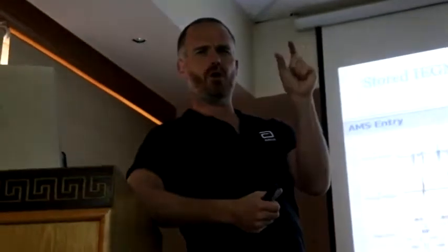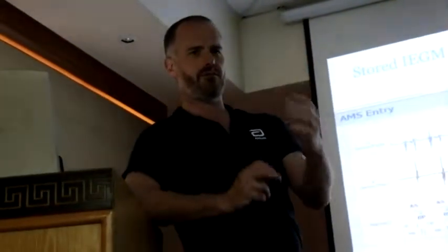So we talked about QuickOpt yesterday, and what it does is it tries to measure the duration of the P wave. If you put a pacemaker into her and went with nominal pacemaker AV delay settings, you would chop off her atrial drive, her atrial kick, essentially. I've seen that with dual chamber pacemakers, and there was a lady with long-standing hypertension. So she had a stiff ventricle, so her ventricular filling was really dependent on atrial kick, right?